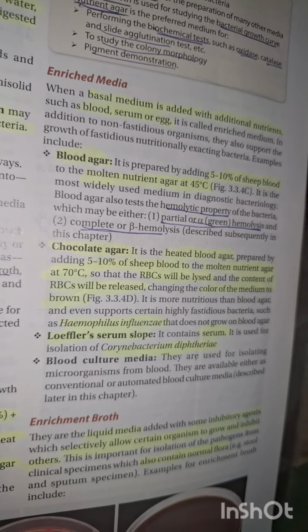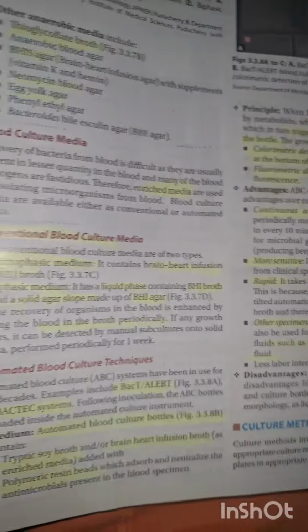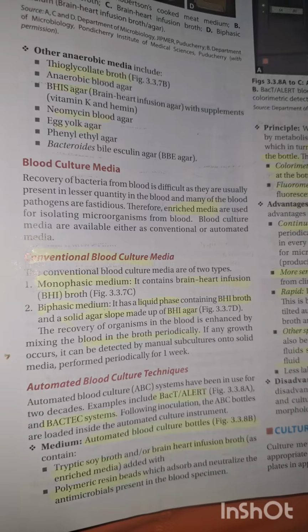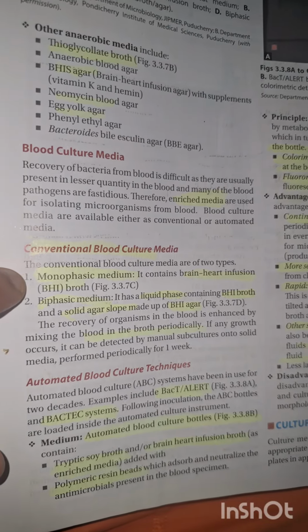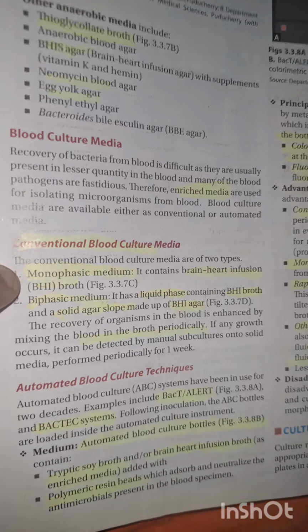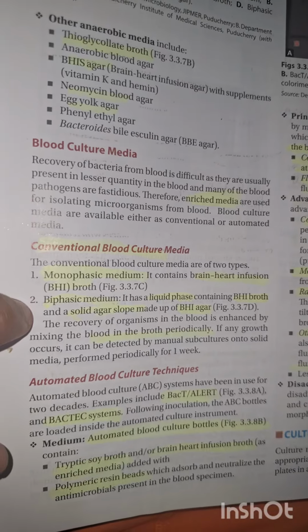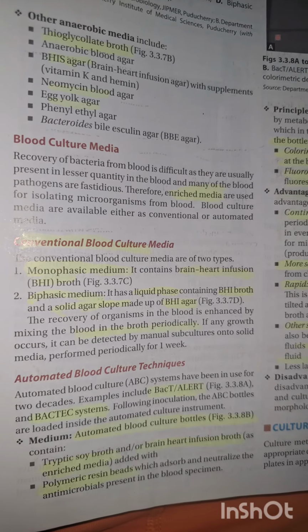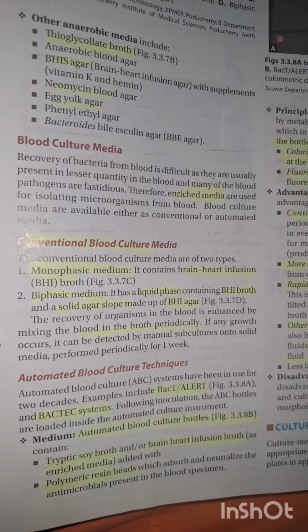And fourth comes the blood culture media, used for isolating the microorganisms from blood. So blood culture media is an enriched media used for isolating the microorganisms from blood. First comes the conventional blood culture media. The first one is monophasic medium, which contains the brain heart infusion broth, and the second one is the biphasic medium. It has a liquid phase containing the brain heart infusion broth and a solid agar slope made up of brain heart infusion agar.